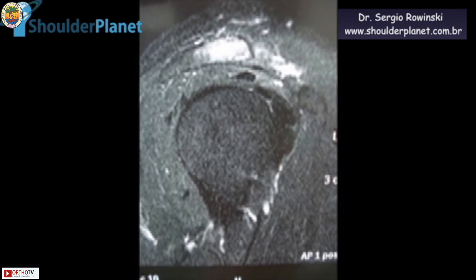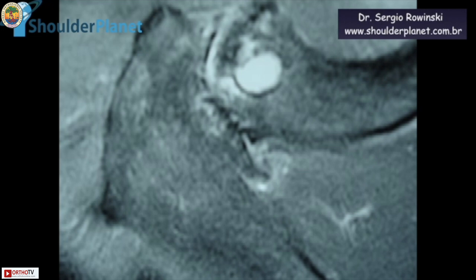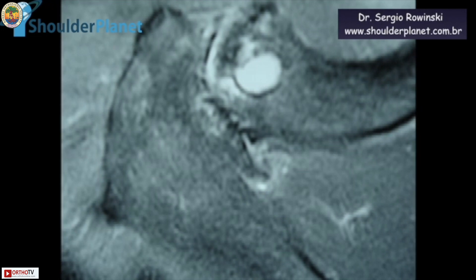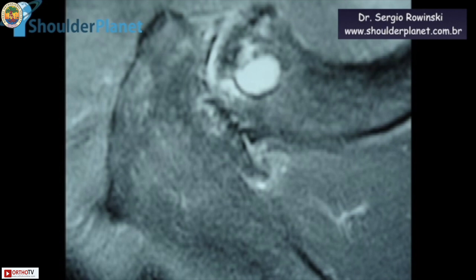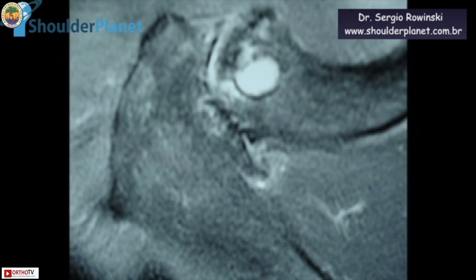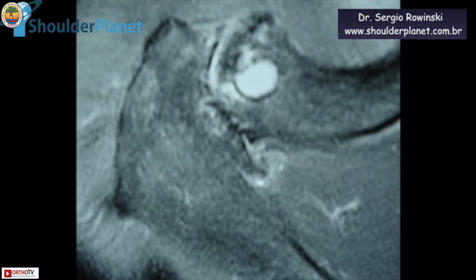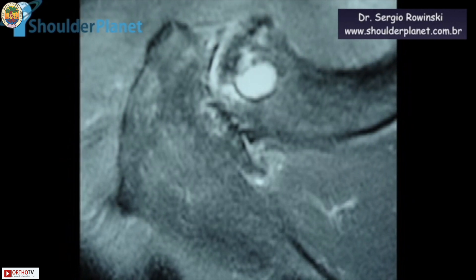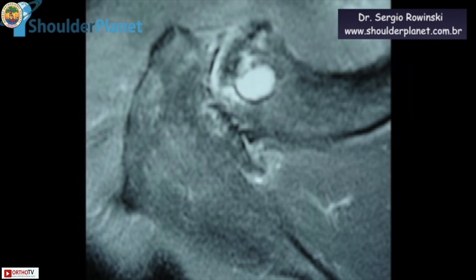We are seeing another MRI image — a T2 fat-sat scan — in which we can see not only edema in the very distal part of the distal clavicle, but a very large cyst in the distal clavicle. That means he had quite an advanced degenerative situation in his AC joint.